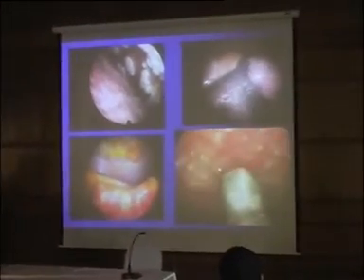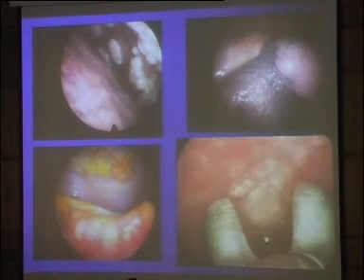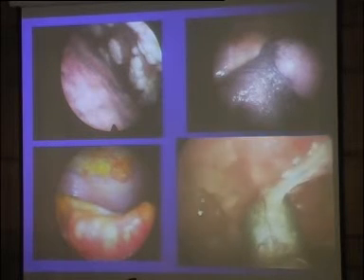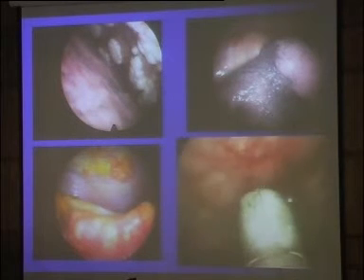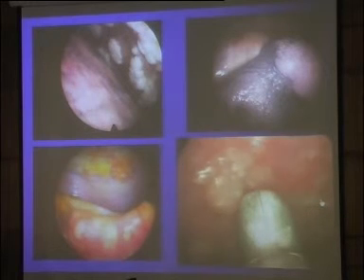Okay, good. What about the technique of the parietal pleural biopsy using optical biopsy forceps? We apply in Marseille what we call the peeling biopsy, as you can see here. You have the nodules on the parietal pleura, you rub the forceps, you grasp the nodule, and we peel the parietal pleura. The lung is here, of course. I just would like to show you that it's a very deep biopsy. Look at this part of the screen. You see the rib when we peel the pleura.